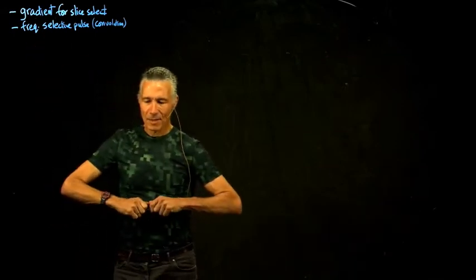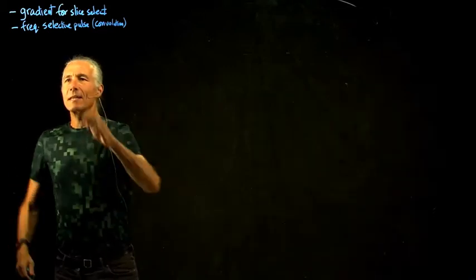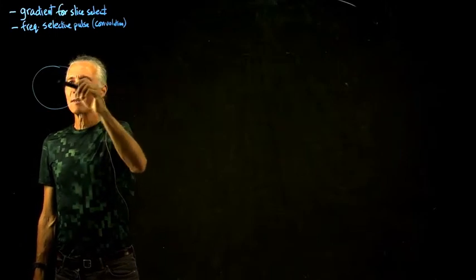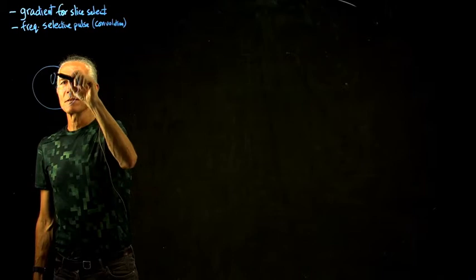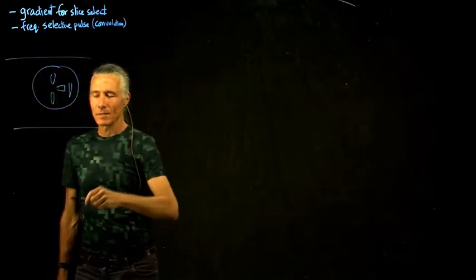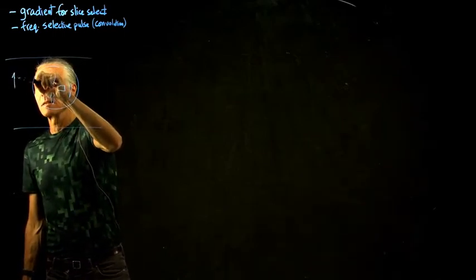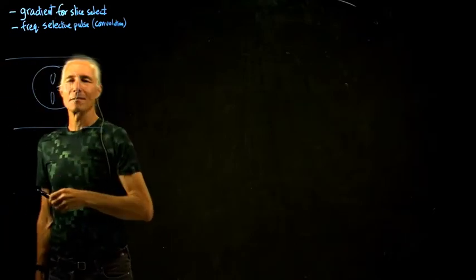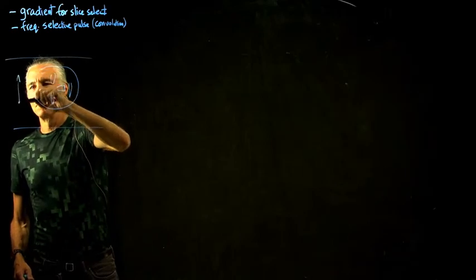So as I mentioned many a time, what is the gradient? The gradient is just an addition onto the B0 field. So here's the person, looking down on the person. So this dimension is the x dimension. Or we'll make it right-handed. So let's see which is right-handed. Yeah, okay. So there's the x dimension.